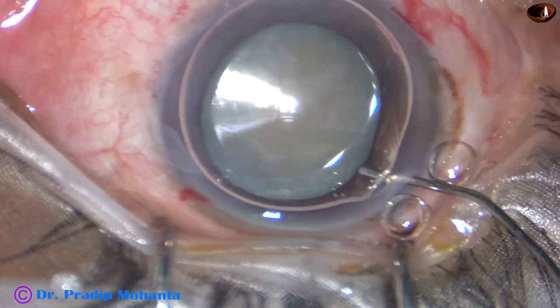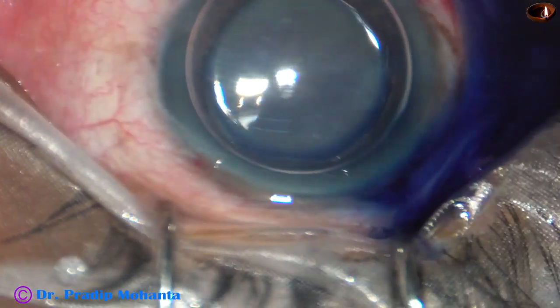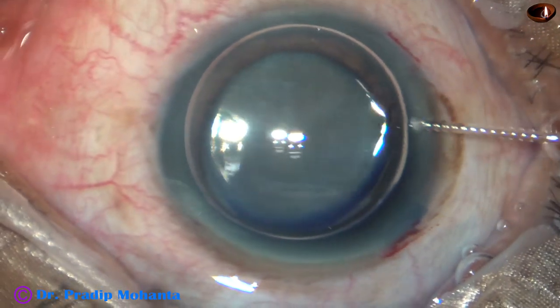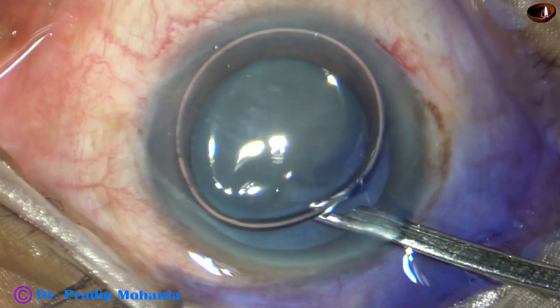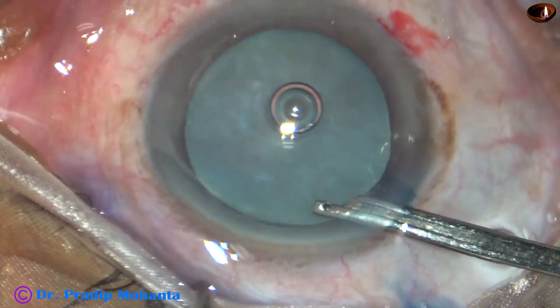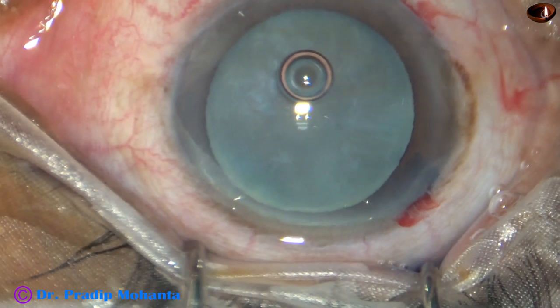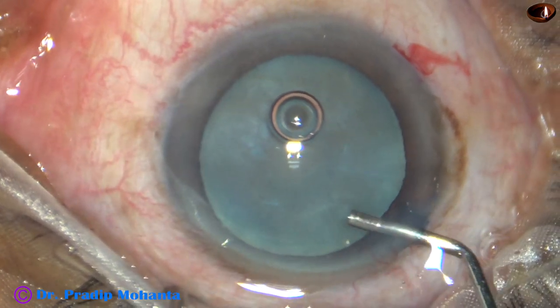This is a hard mature cataract. By this time, the incisions have been made. The capsule has been stained with trypan blue dye, and now the dye is being washed out using BSS to wash the dye out of the anterior chamber.